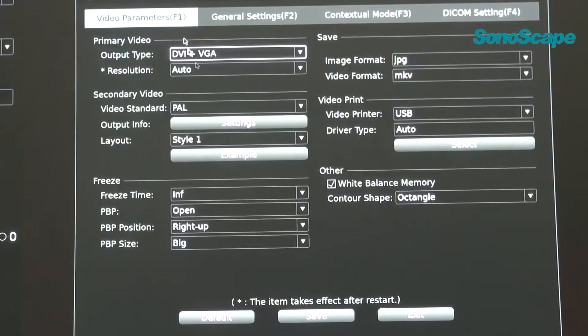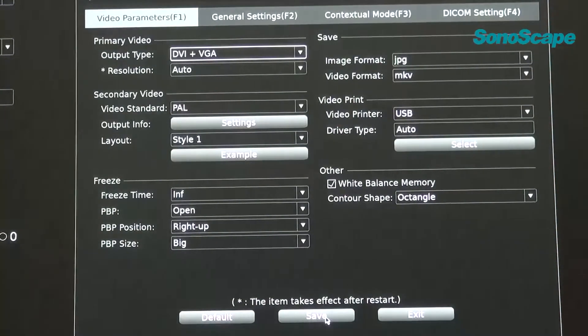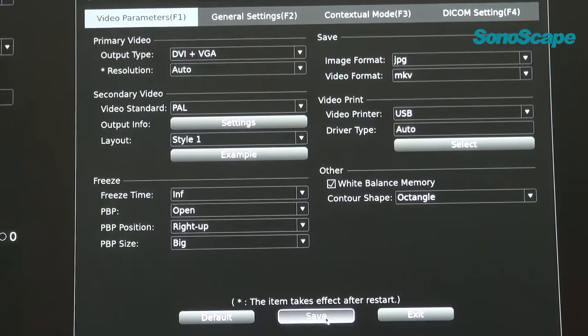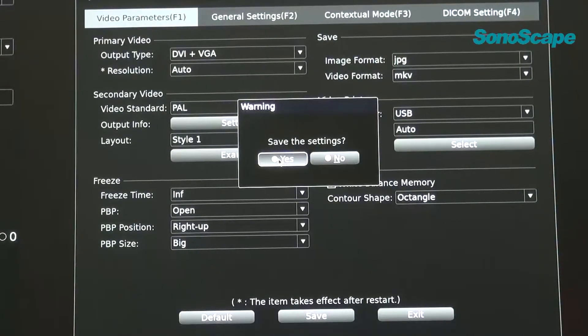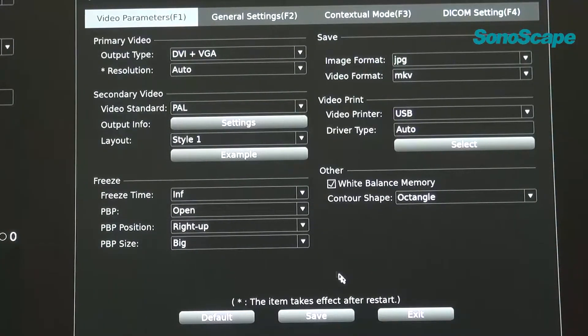Finally, F4 is for DICOM setting. You can do the settings to connect with the DICOM of the hospital. When you finish all the settings, do remember that. Click save. And then, yes. That means you save all the settings.